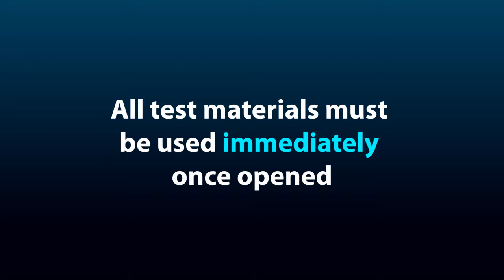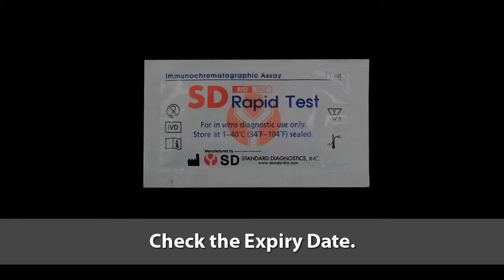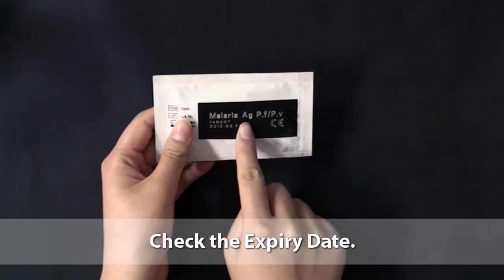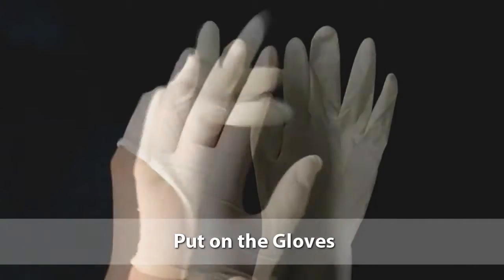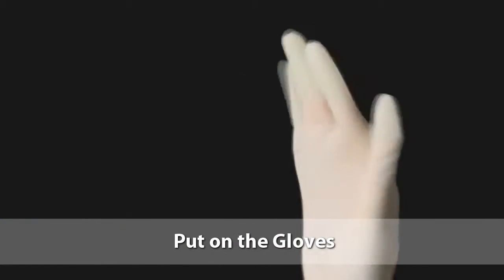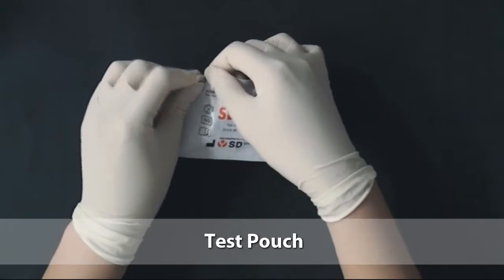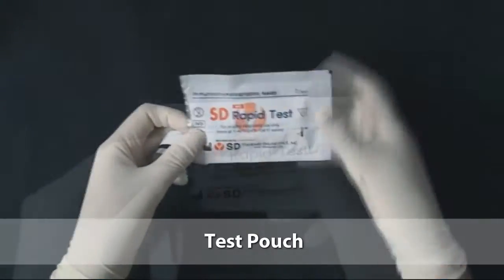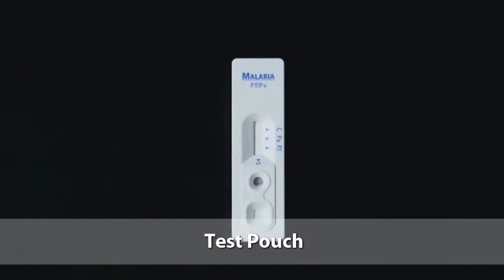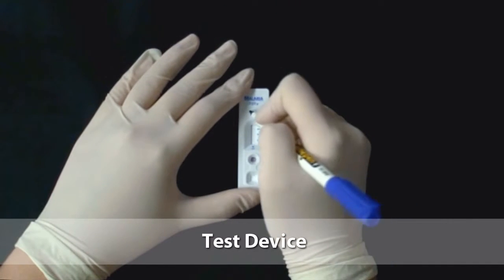Let's begin the test. Check the expiry date on the back side of the test pouch. If the expiry date has passed, use another kit. Put on the gloves. Remember, use new gloves for each patient. Open the test pouch and set out the test device. Write the patient's name on the test.